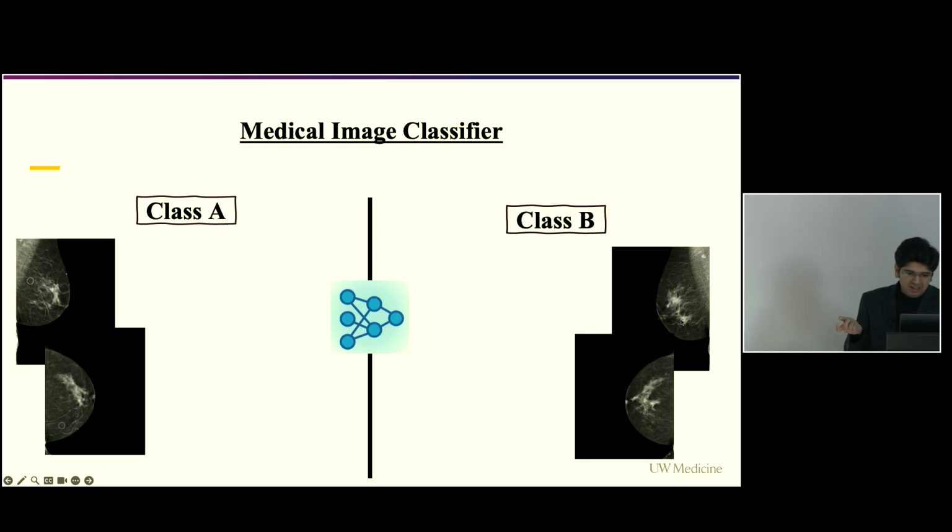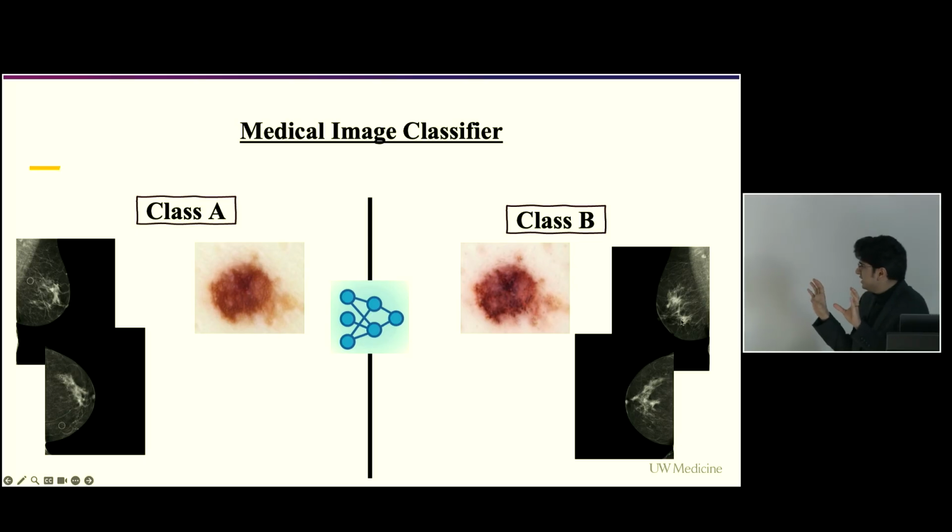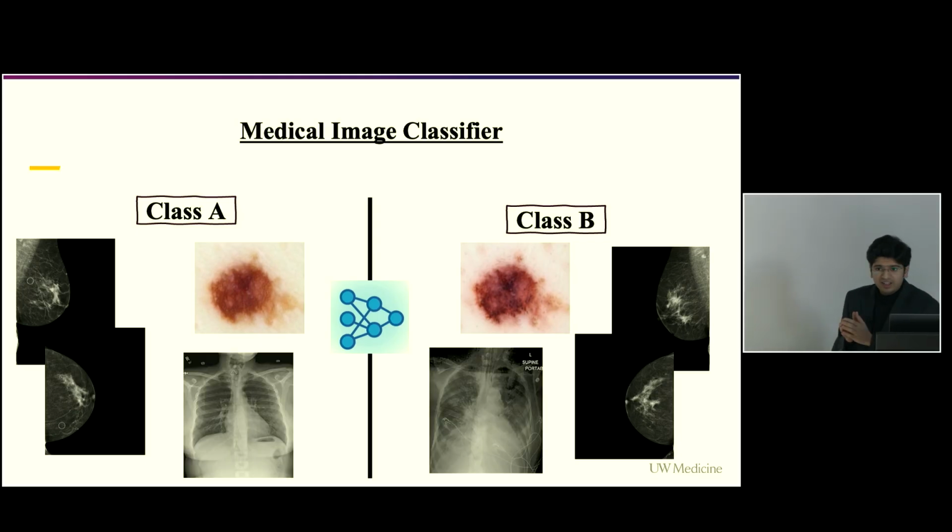Similarly, it could potentially try to classify these pictures of skin, like whether they are malignant or not. So class B is the one with a lesion, for example. Or in the case of chest X-rays, class B is the one with a disease, and class A does not have a disease. So how would we go about understanding the interpretation of this medical image classifier? And I'm not saying this is a generalist model. This is just for our explanation. And of course, the decision boundaries also don't really look like probability functions.